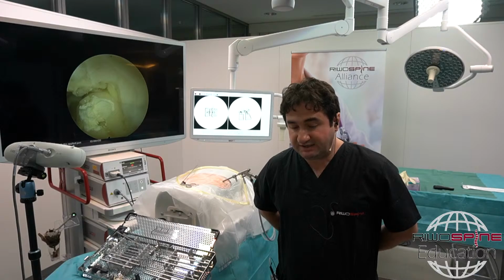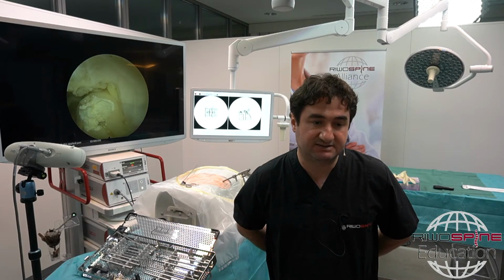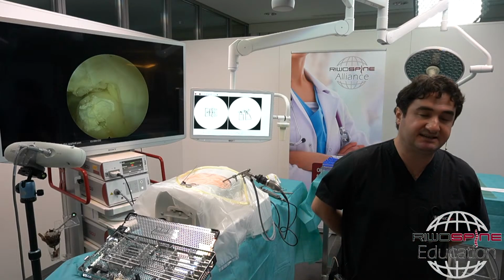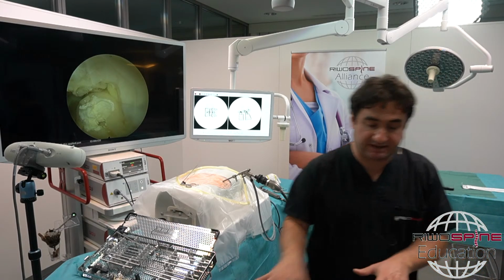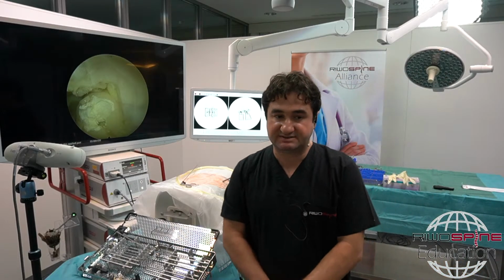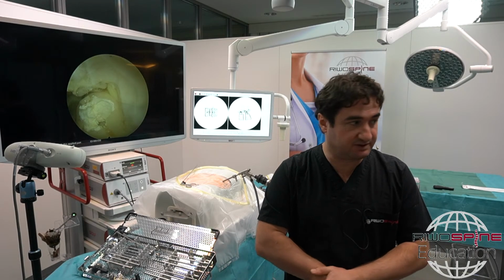and usually for the extraforaminal L5-S1, we start pure extraforaminal first. We place the needle at the caudal side of the junction of pedicle to the ascending facet. Then we start the operation under our visual control, dissect all the tissues, try to find the exiting nerve root and this space and the herniation there. But these are the most difficult operations of the transforaminal approach. Maybe you should keep it for later.